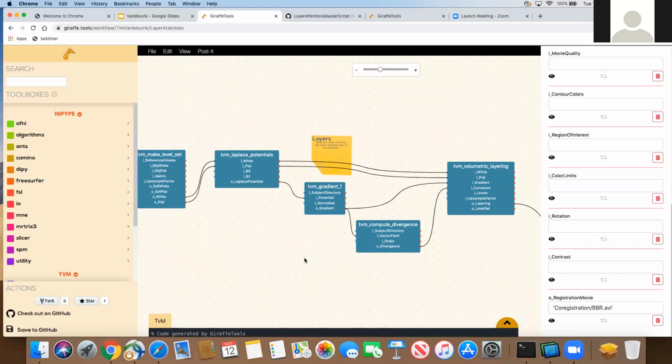One good idea, right? So this T1 weighted MPRAGE is nice. I think that is quantitative T1s. Get rid of the T2 star contributions, but also kind of a bold-weighted FLASH. So for example, we're just talking about the point spread function. There's ways to get FLASH undistorted, bold-weighted, with the exact same readout and no distortion. And this is nice because you can get an exact contrast match to the bold data. And this can also be a nice sanity check.